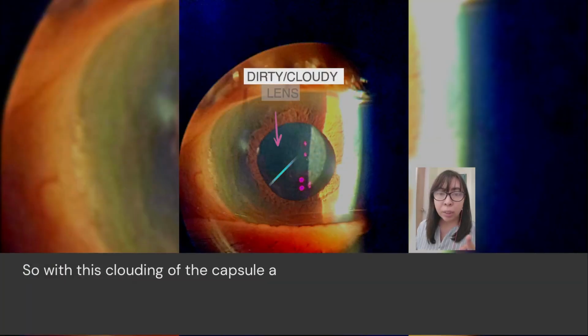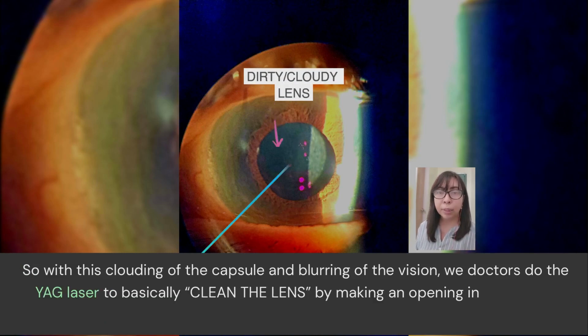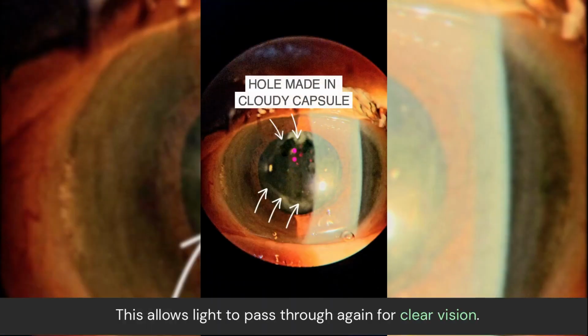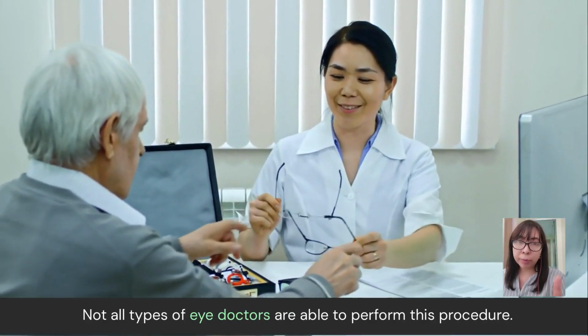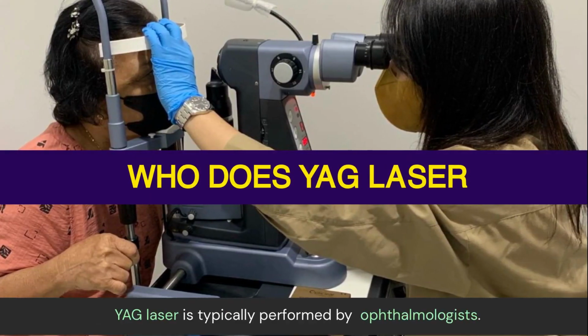So with this clouding of the capsule and blurring of the vision, we doctors do the YAG laser to basically clean the lens by making an opening in the cloudy capsule. This will allow the light to pass through again for clear vision. However, not all types of eye doctors are able to perform this procedure because YAG laser is typically performed by ophthalmologists.